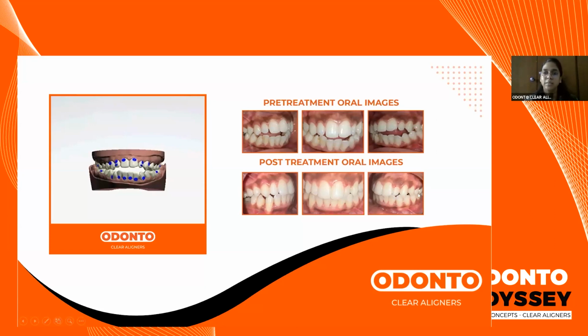So we can see that the bite at the posterior region is not changed. It's a very stable bite. We haven't altered it. But at the same time, we have achieved our treatment goal of closing the anterior bite as well as alignment of teeth. So I will just take you through the video, and it shows how sequentially we gain space.